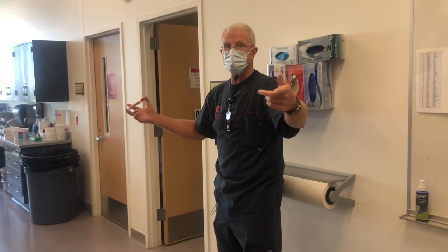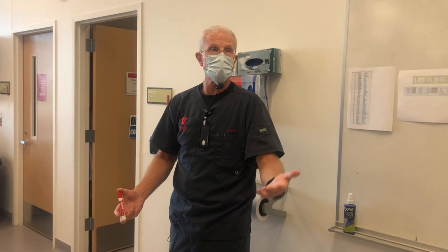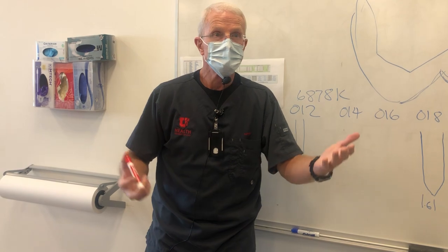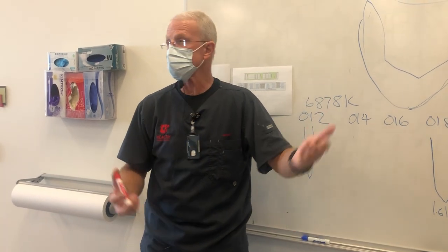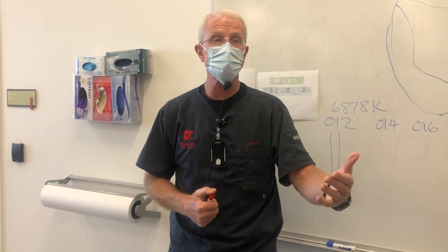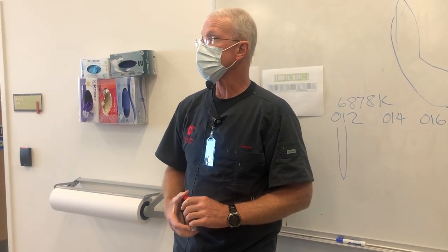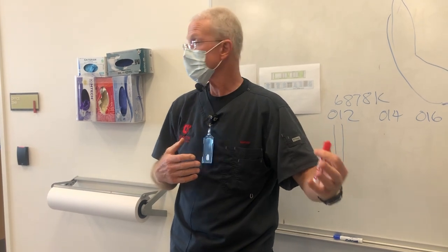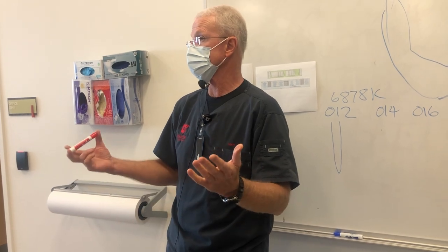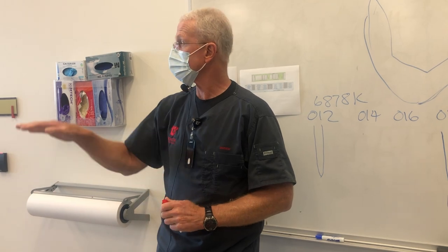Doctors, do you have preferences? Even amongst us, you're going to find, and that's why we show you both ways of doing it. Any strong preference, one way or another? No, there isn't. So they'll use either margin probably interchangeably a lot. But if you're all ceramic, glassy ceramic, you'd probably go to a rounded shoulder. But I would say all of us use both. I do chamfer probably quite a bit more frequently, especially if I'm doing zirconia or metal. It's a chamfer. So, anything else on that?